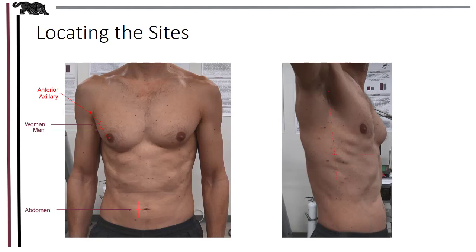The mid-axillary is also a vertical fold, and it's on the mid-axillary line at the level of the xiphoid process. The mid-axillary line is simply the armpit straight down through the hips, and the xiphoid process is found inferior to the pectoralis major. This bony structure is often easily palpated by having the client suck in the abdomen or inhale deeply.